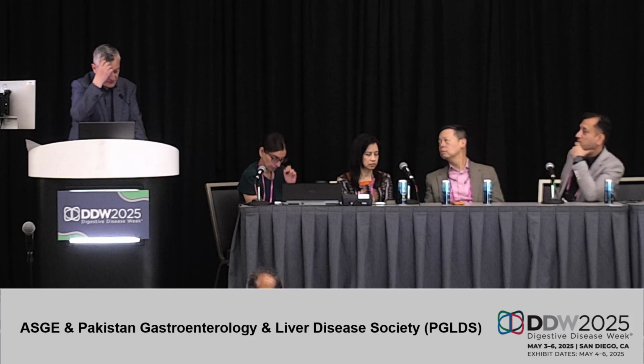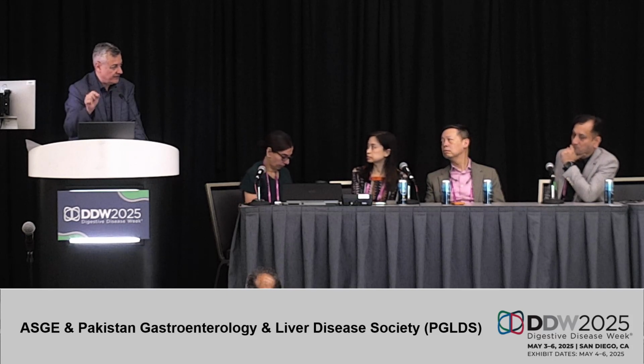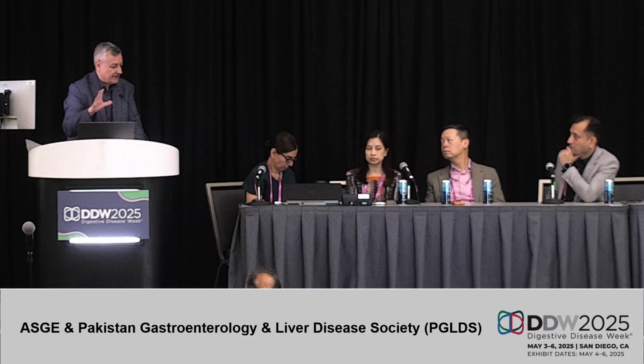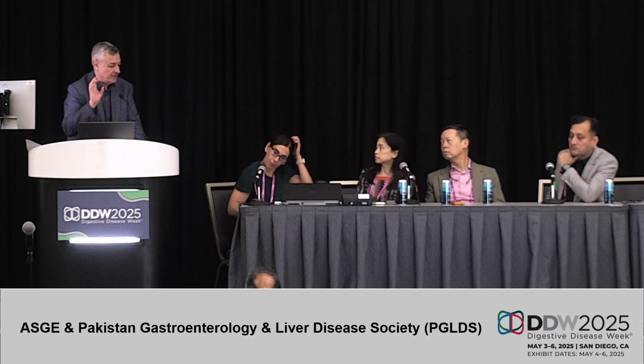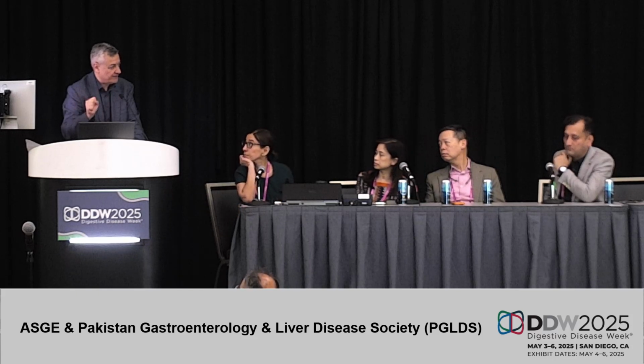Yeah, it's an interesting question. There are studies on using either elastography or contrast enhancement for targeting of fine needle biopsies. I think the results are still a bit controversial. The studies didn't show better results with EUS-guided FNB when using elastography or contrast for guidance. What we do, if you have a very large tumor with necrotic areas, we usually do contrast.